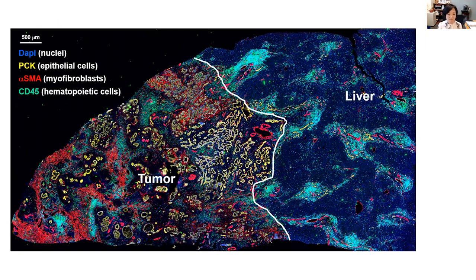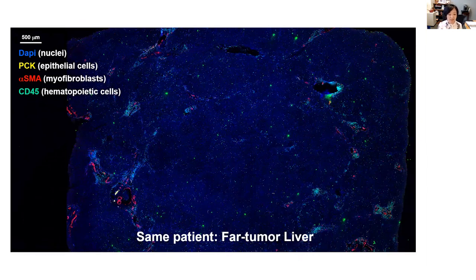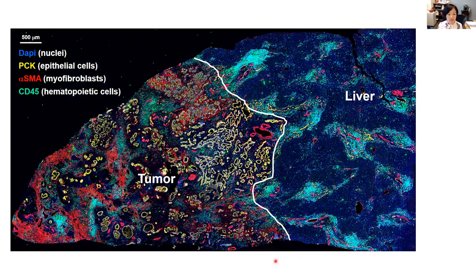But what I want to bring your attention to today is the liver next to this monstrous tumor mass. You may notice that there is actually something wrong with this liver. There are very weird cell organizations that also have these different cell types within. And you might ask, is this how a normal liver looks? What I can tell you is it's not. This is exactly the same staining that we did on the far-tumor liver from the same patient. So exactly the same liver, basically. And you can see how this far-tumor liver looks different compared to this near-tumor liver.